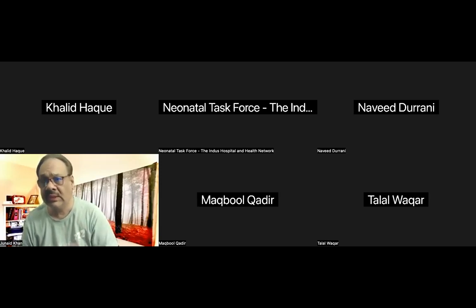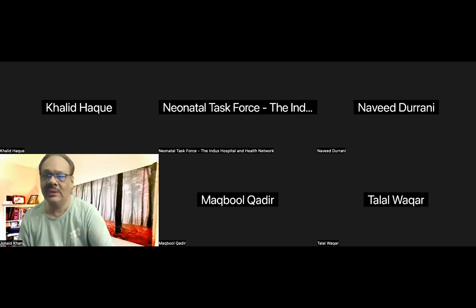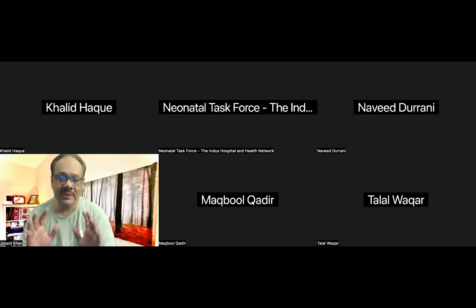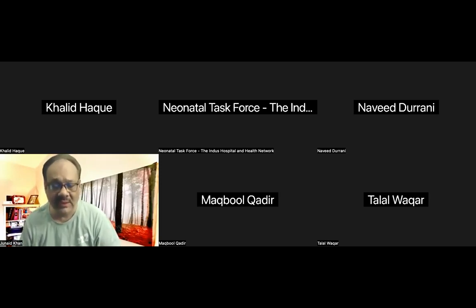But again, to young fellows and very enthusiastic young people, please don't start putting the probe on and then just interpreting. Acclimatize yourself with the machine and with the anatomy, as just discussed by Naveed, and then go through some references and do the practice, and check your interpretation with the radiologist or your seniors. Thank you very much, sir.